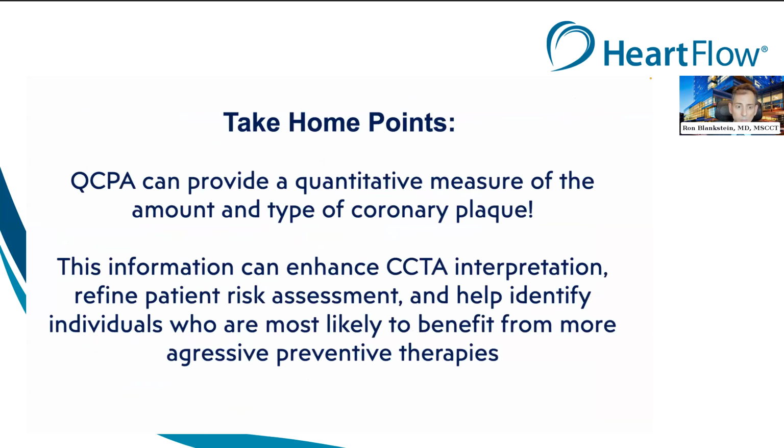So our take-home point is that quantitative coronary plaque analysis can provide a quantitative measure of the amount and type of coronary plaque. And by type, I mean the specific morphology that we talked about, which is non-calcified or low attenuation plaque or calcified plaque. The information can enhance coronary CT interpretation, refine patient risk assessment, and also help identify individuals who are most likely to benefit from aggressive preventive therapies.